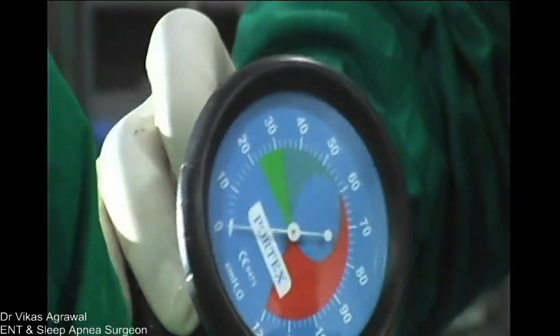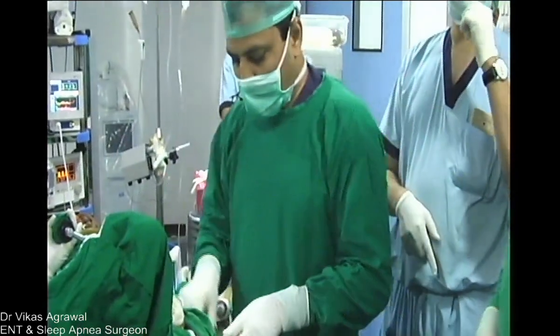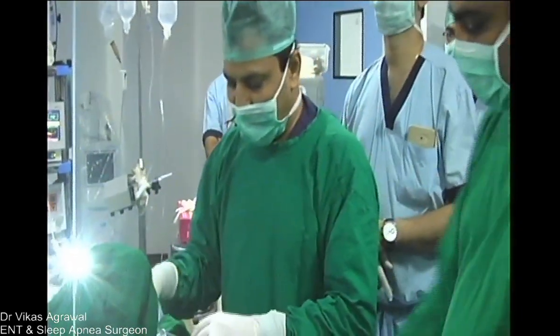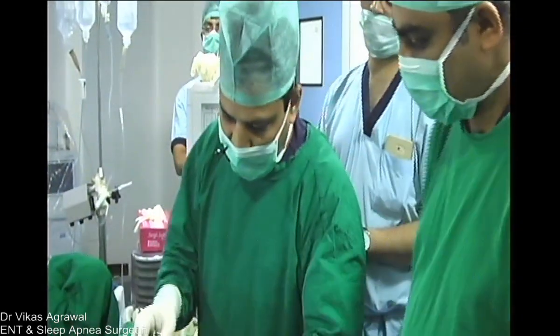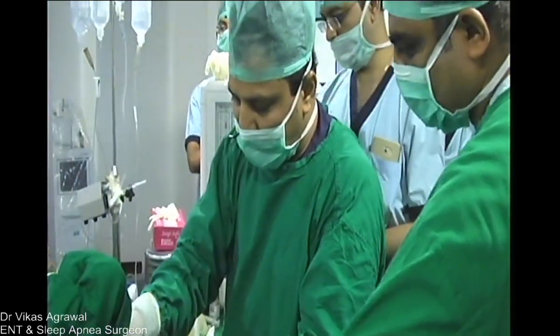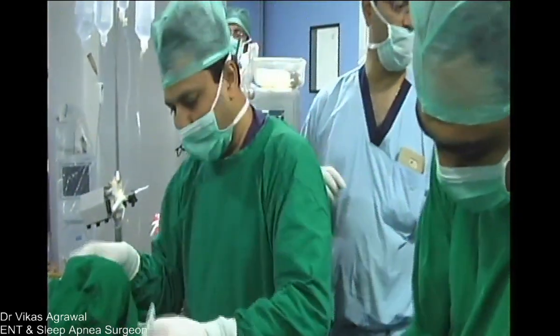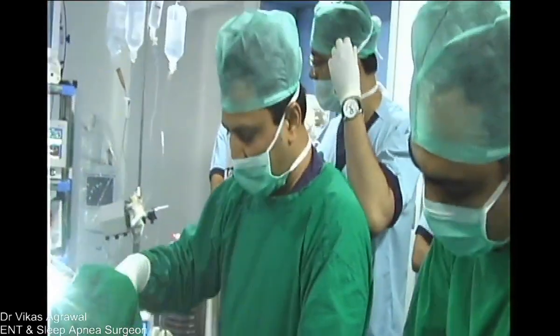This is only till extubation, right? Now since we have inflated it very highly, it can come out. So it will not bleed. Even if there is a little vessel which has remained open, it will still not bleed while extubating, because during extubation, if any blood goes into the larynx, it can create a problem. Now we'll just see inside.